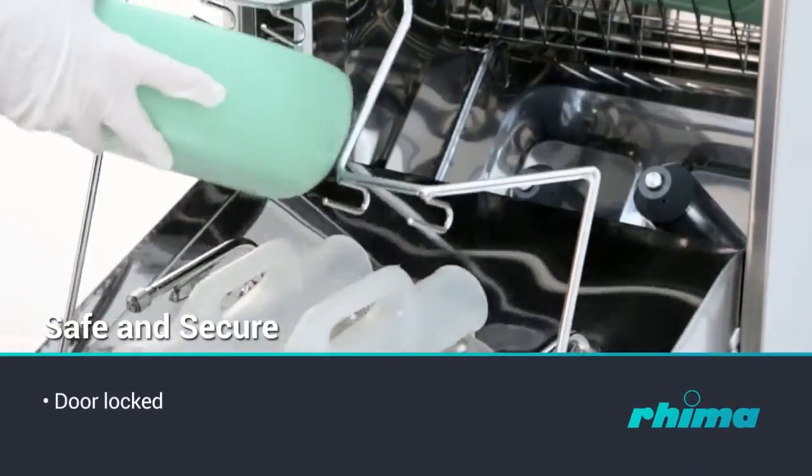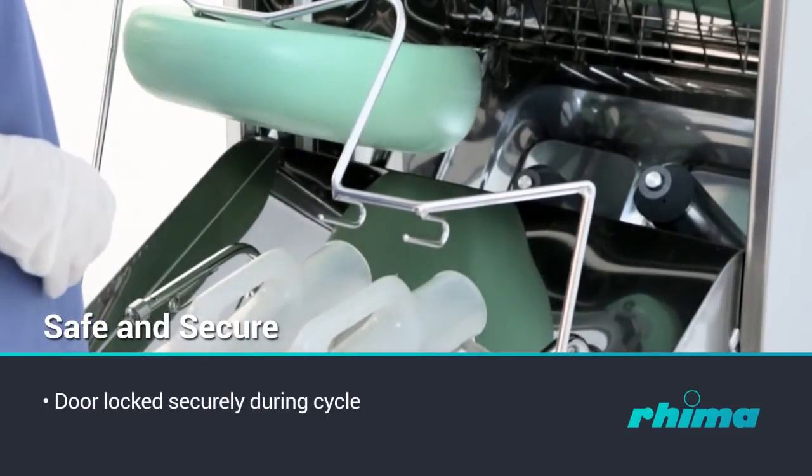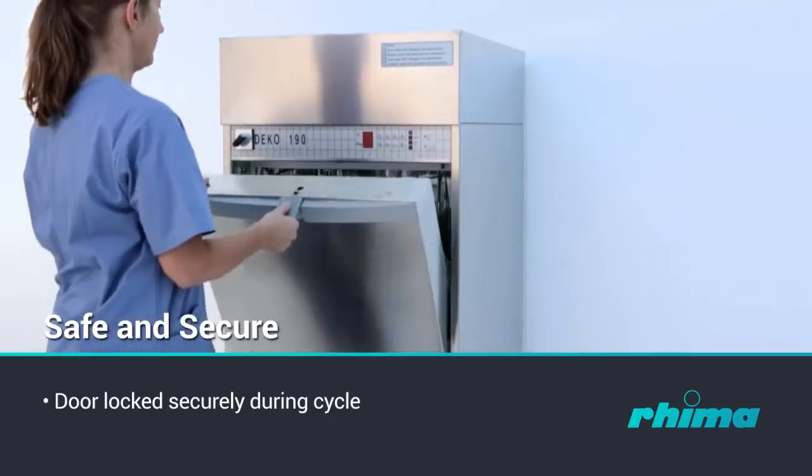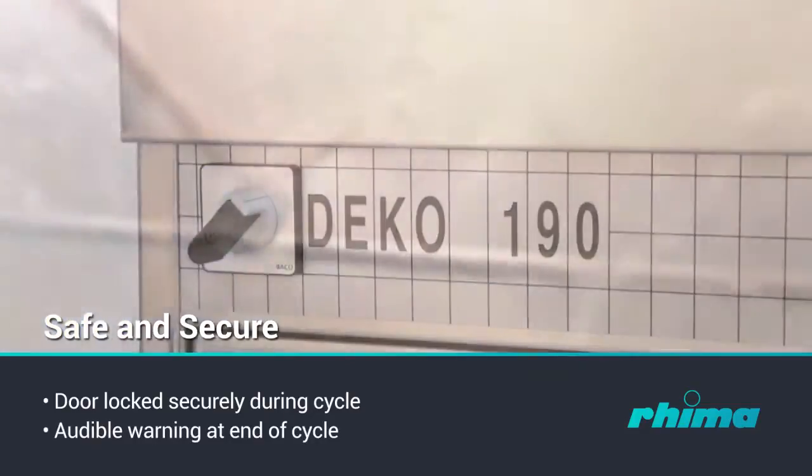The door is locked securely during the cycle. A green indicator will advise when the door is unlocked for opening. An audible indicator may be added to draw attention to the ending of the cycle.